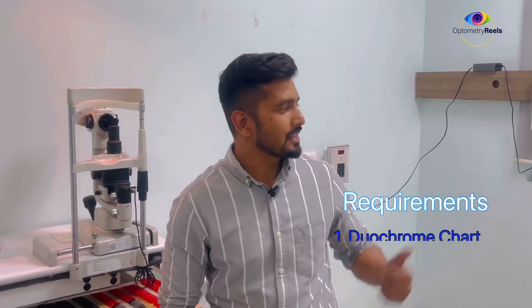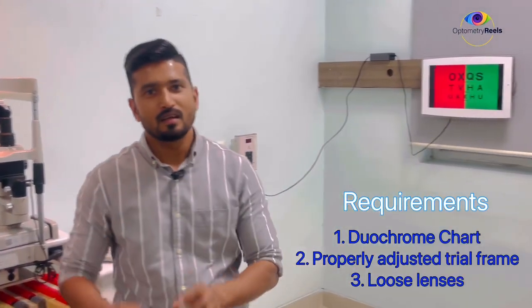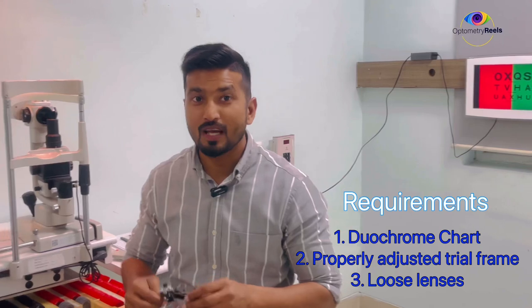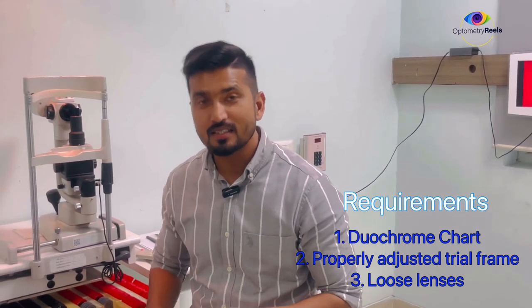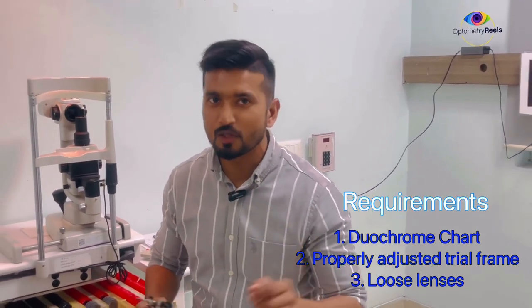The prerequisites for the Duochrome test are the Duochrome chart, a trial frame and trial lenses, and the room needs to be dimly illuminated.